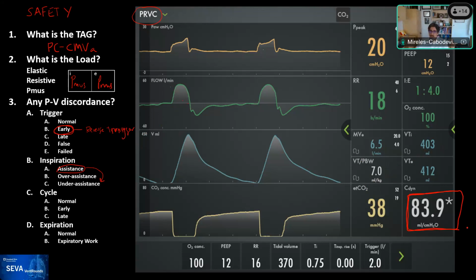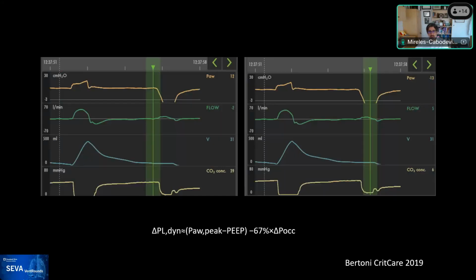I mean, I know that we tried to get to 6 dogmatically, but you could say that's still within what the studies have done. So, over the last recent years, we have been starting to look at the Pocc. So let's bring out the Pocc. Are you ready? For the viewing pleasure of the team, here it is.